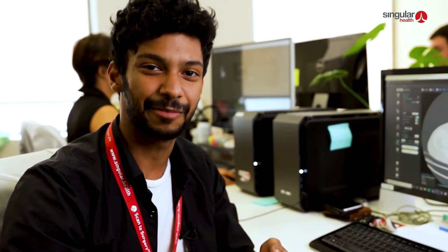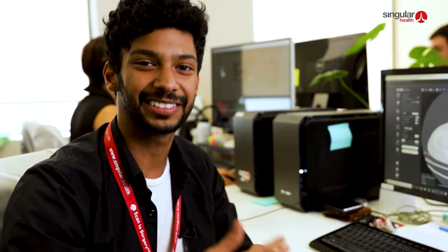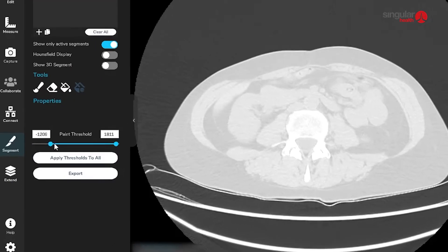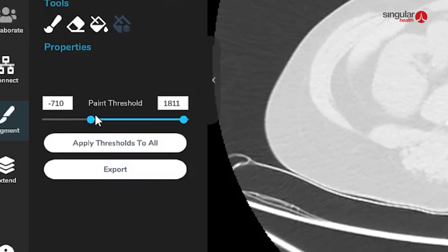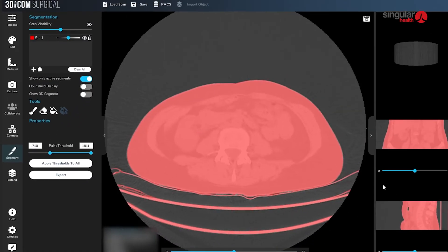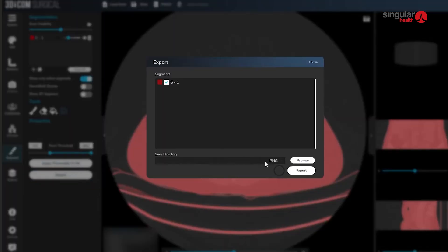Previously we had to go to individual slices and manually paint every slice to get our segment done. Now we can simply change the threshold that we want to segment and with one click it segments all of the slices in the scan. From there we just go to the exporting window, select where we want to send it, and send it to the desktop.